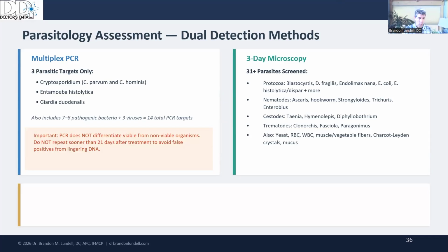Someone who's trained is actually looking at it and saying, all right, maybe the yeast didn't survive the PCR, maybe it didn't survive transit, maybe for some reason it didn't grow, which there's many reasons why, which is why you have to have multiple targets, multiple aspects of evaluating a stool. And most companies only use 1 or 2, whereas Doctors Data uses 4.